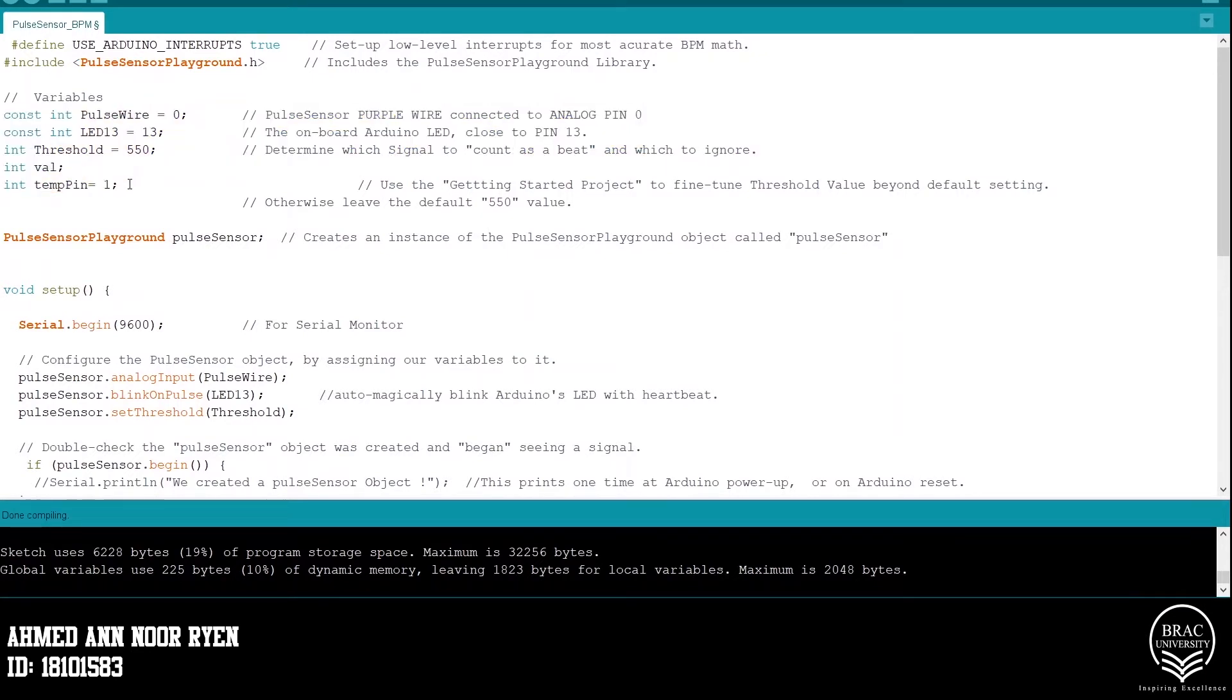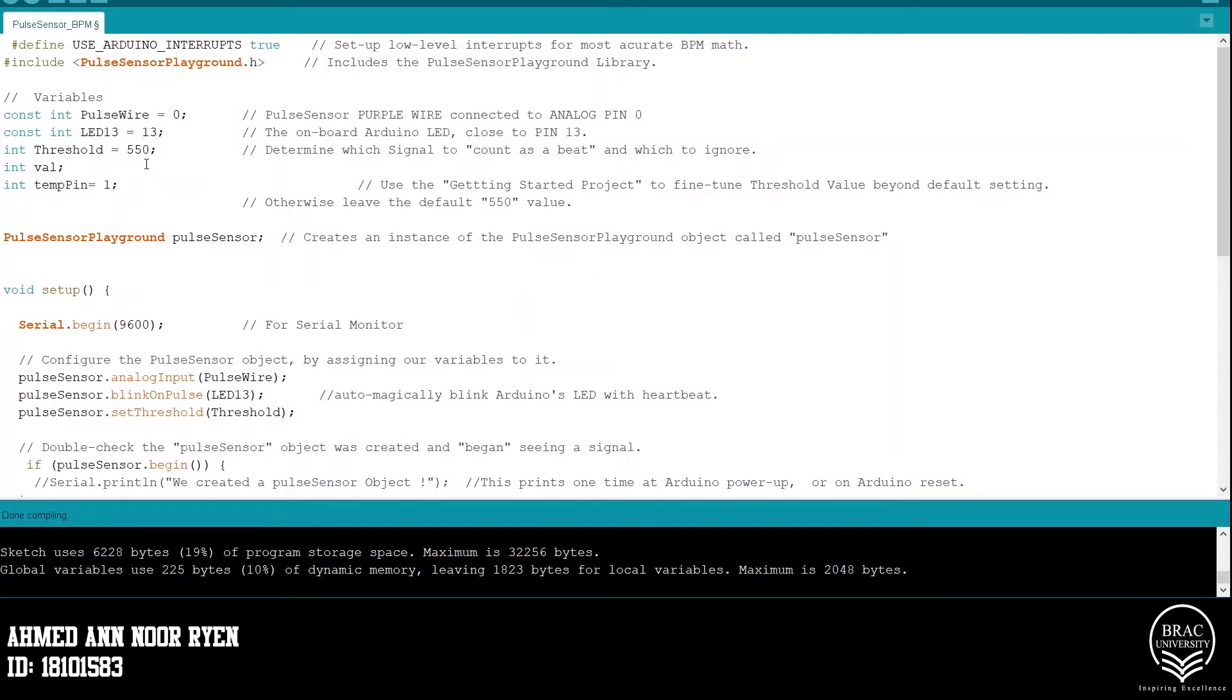Here, the pulse wire is connected to pin 0 and LED 13 is connected to pin 13. We also assign the threshold about 550 and if a signal crosses the threshold, it will be considered as a beat.